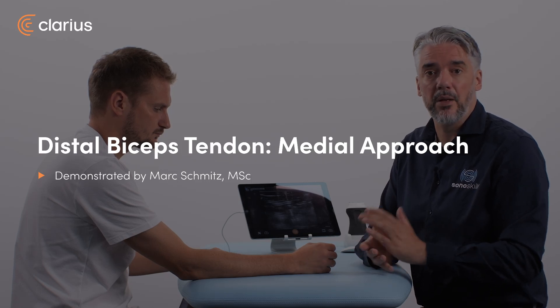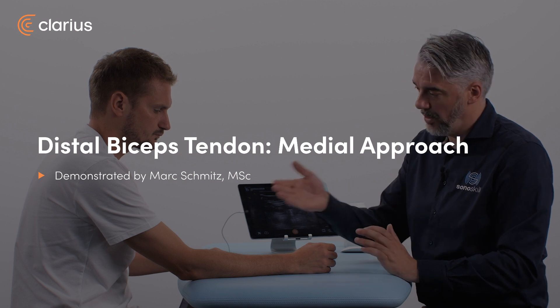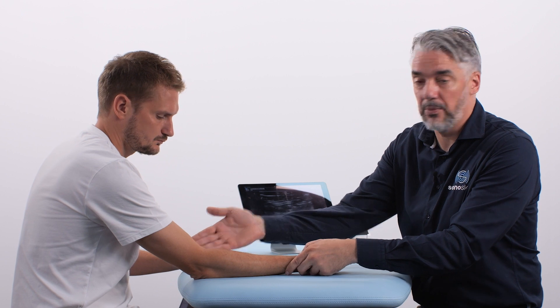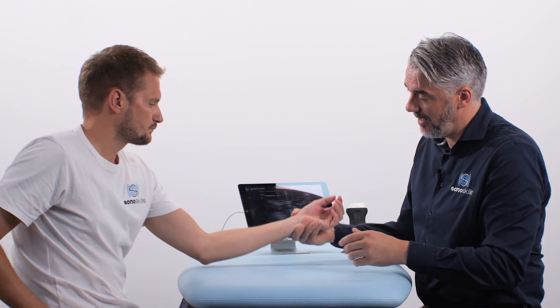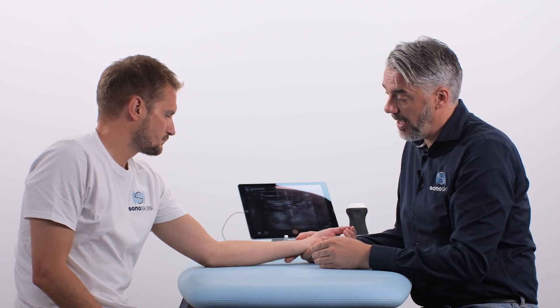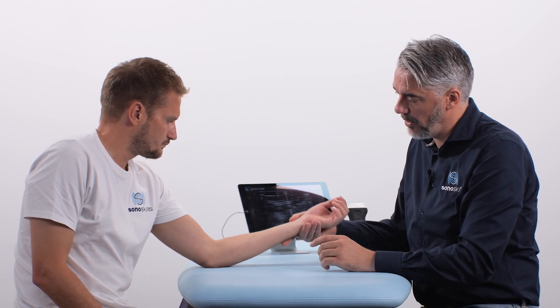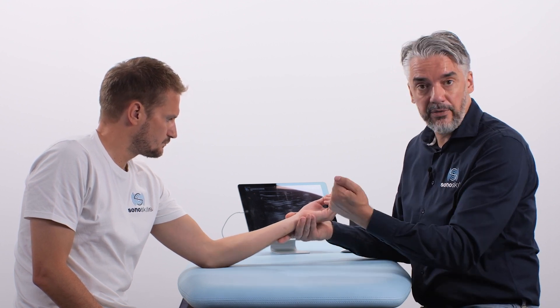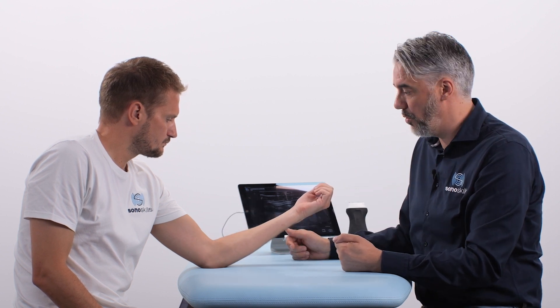The fourth and last approach is the medial approach to scan the distal biceps tendon. For didactic purposes, we are going to take the other arm. We're going to scan on the medial side, and to do so, the tendon should be a little bit on a pre-stretch. So we're going to ask the patient to actively hold this somewhat flexed elbow position.